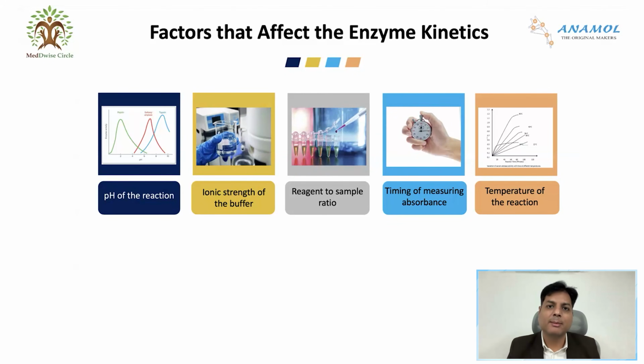Fourth, timing of the absorbance, whether we are taking the absorbance in the lag phase of the reaction or we are noting the absorbance in the log phase of the reaction. And fifth, temperature. If we increase or decrease the temperature of the reaction, how does it affect the enzyme kinetics? All of this we discussed in our previous video.